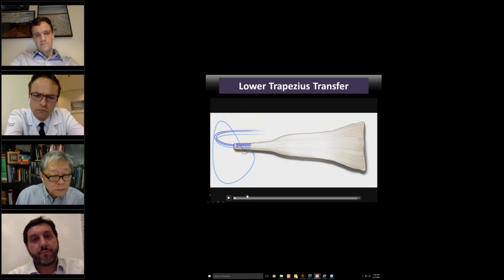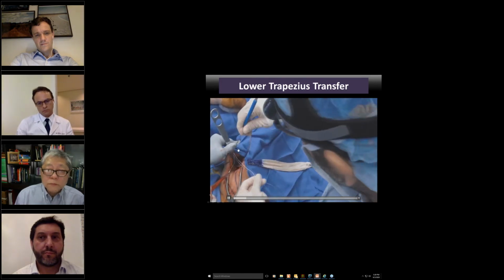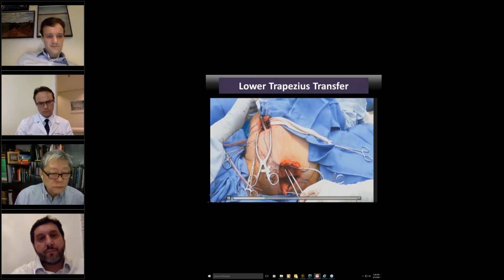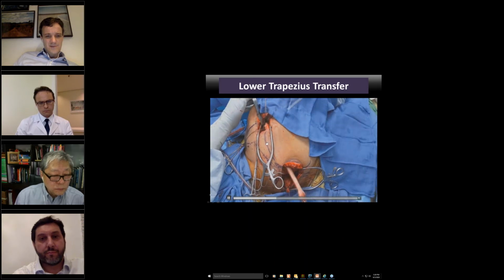So here you can see the same way. You can see, again, we prepare the Achilles tendon. You attach it with the endo buttons because you'll be able to go around the proximal implant. And the same technique as I showed you before, but of course a bigger open incision. And here I always do lateral approach.